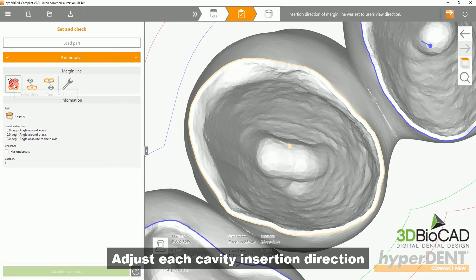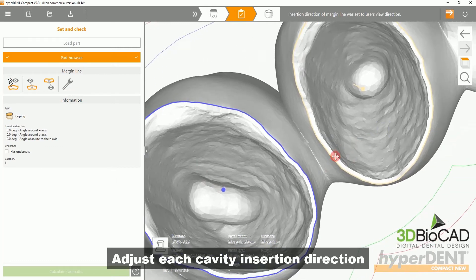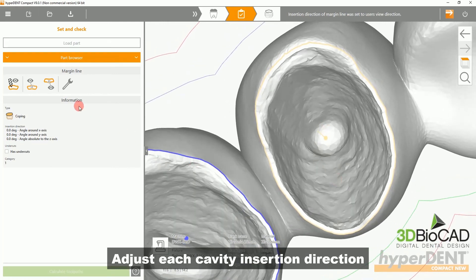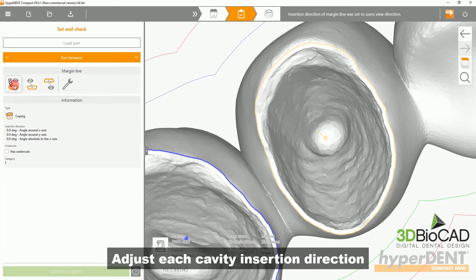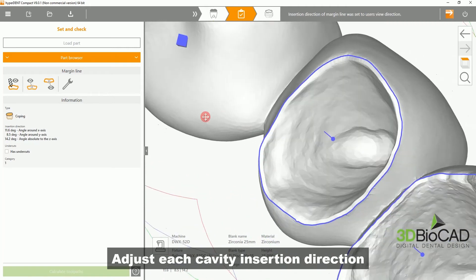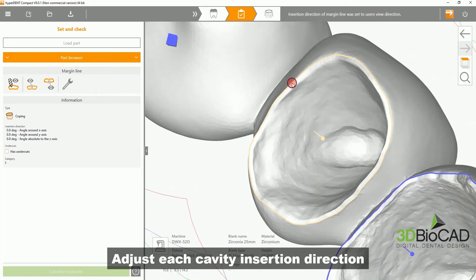As displayed in the video, the insertion direction is based on the view direction of how you are looking at your cavity. Please ensure you do this with each cavity to ensure an accurate insertion direction.